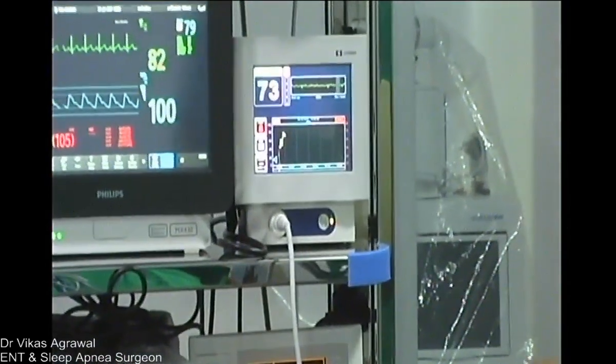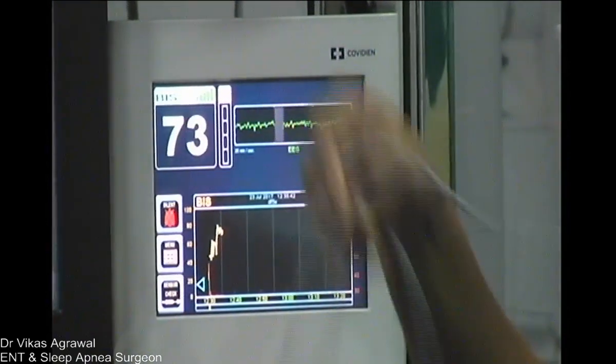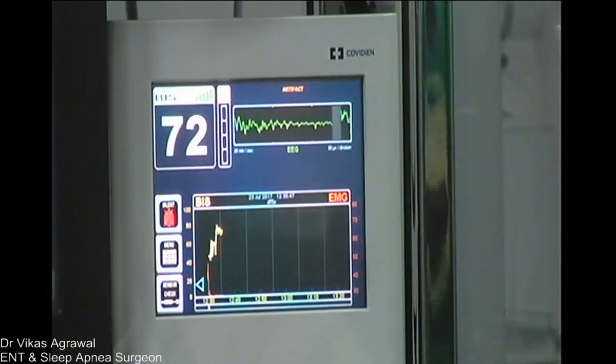So great. Yeah. What we'll do is, I think Dr. Vikas has a few slides that he'll be sharing. We're just setting that up to share multiple DISE videos.